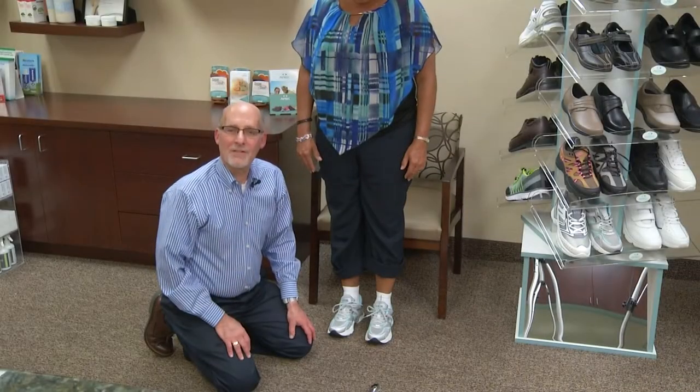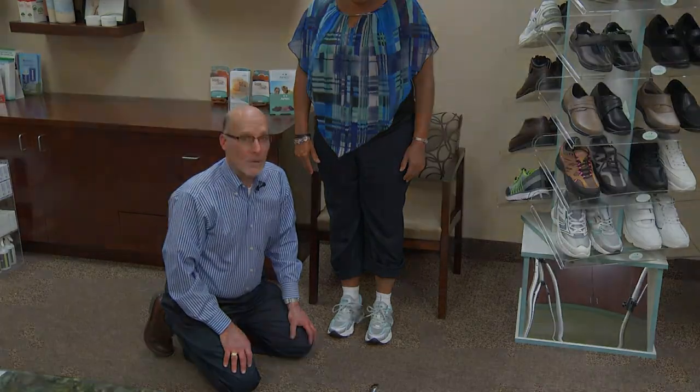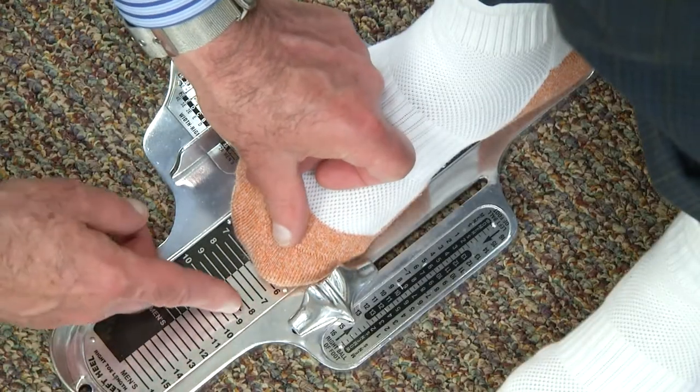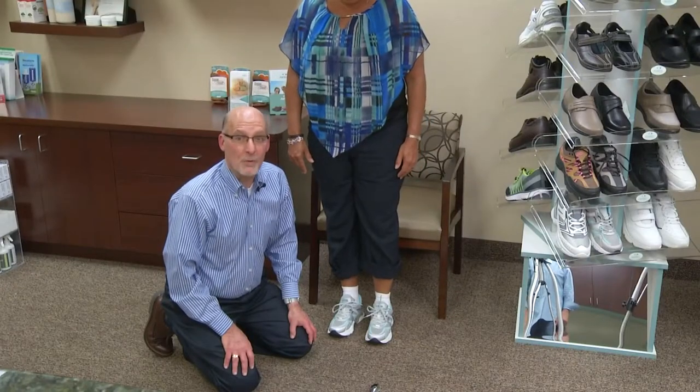Don't be surprised if your patient feels the shoe is too big. This is because they probably haven't had their feet measured for a long time and have been wearing shoes that are probably short and narrow.